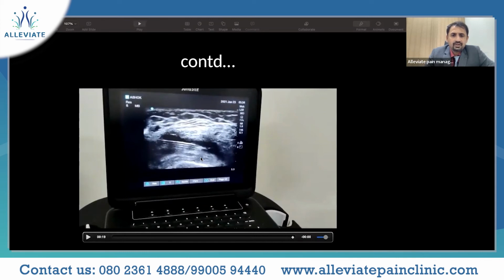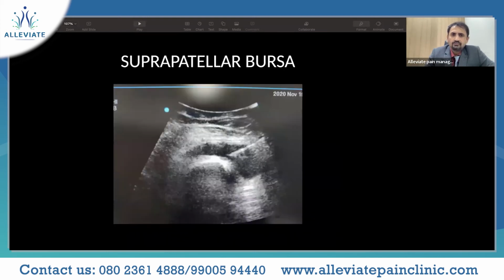It could be a corticosteroid injection, it could be a hyaluronic injection, it could be a Botox injection in cases of progressed arthritis. We also supplement hyaluronic acid with all our radio frequency ablations, which we are doing at our place. Most of these procedures, you should understand that even a linear probe is sufficient.